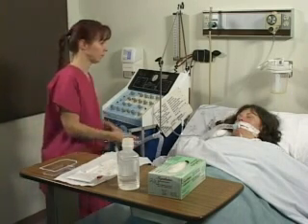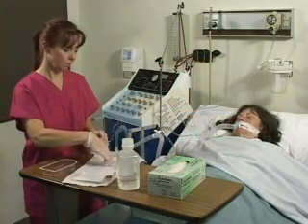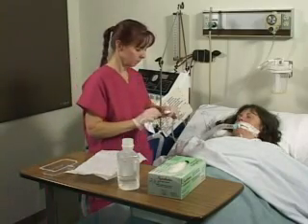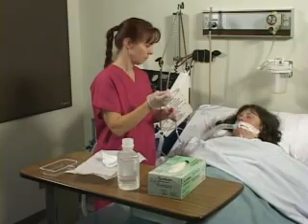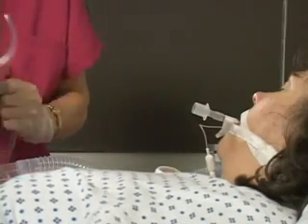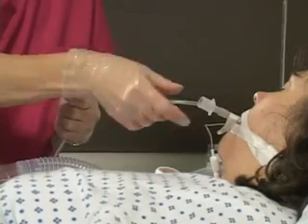Be sure the connection of the ventilator tubing to the endotracheal tube is loose enough to be released with one hand. Open and put on the sterile gloves. Grasping the paper wrapper and the suction catheter, connect the suction catheter to the suction tubing. Remove the paper wrapper from the suction tubing, maintaining its sterility. Disconnect the endotracheal tube from the ventilator. Quickly but gently insert suction catheter as far as possible into artificial airway without application of suction.